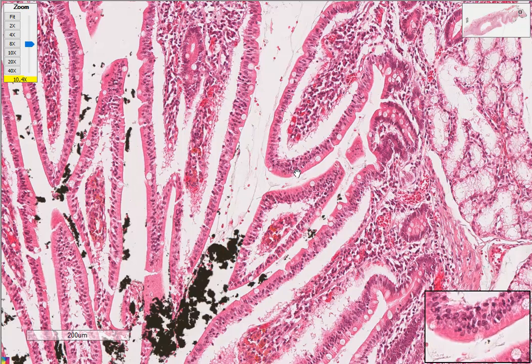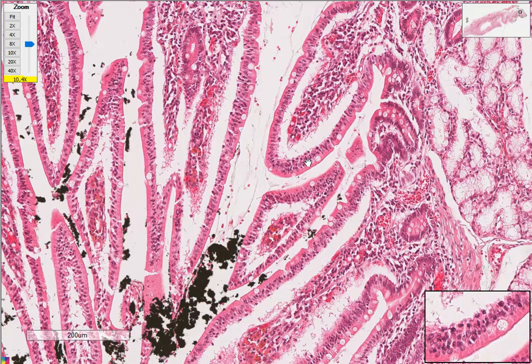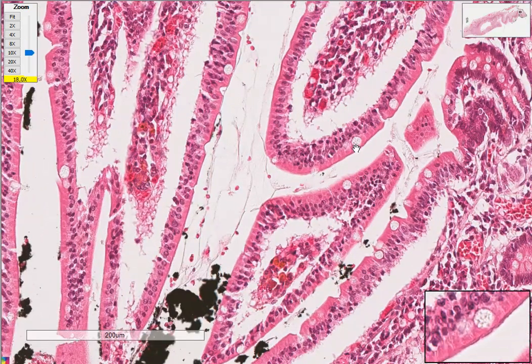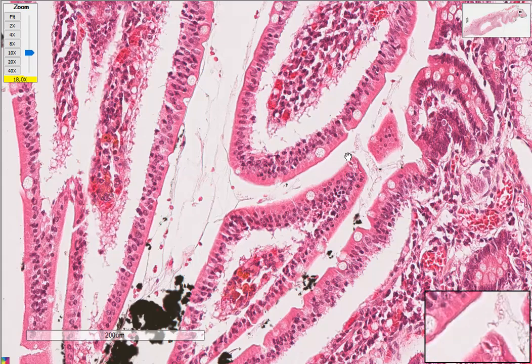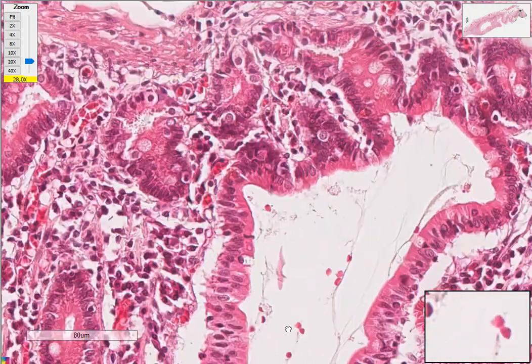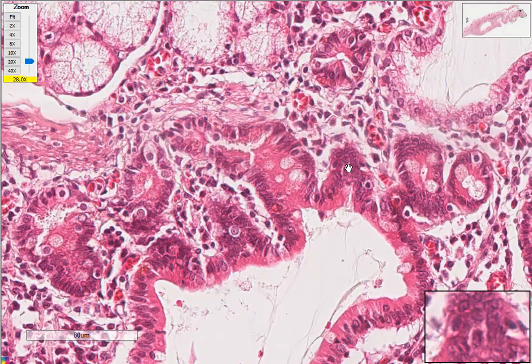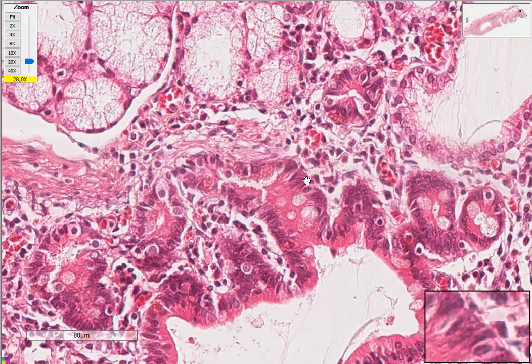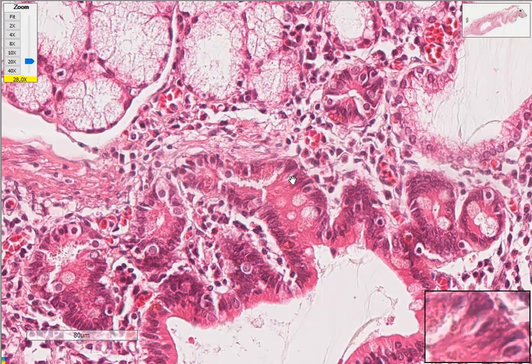As I mentioned, the enterocyte helps with absorption of nutrients, glucose, amino acids, lipids, and they contain enzymes for final digestion at the surface, right? And then your goblet cells secrete mucus to lubricate your food material that comes through from your stomach. And then there's what we also call Paneth cells. Let me try and highlight one Paneth cell. They have eosinophilic granules. I think here's a Paneth cell. Just look at the small box again on the right.